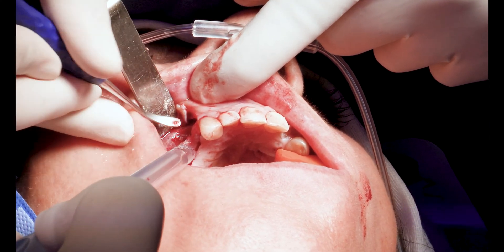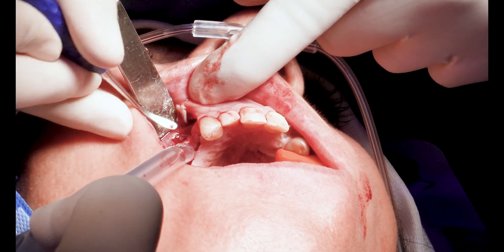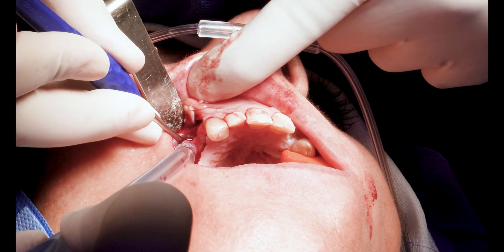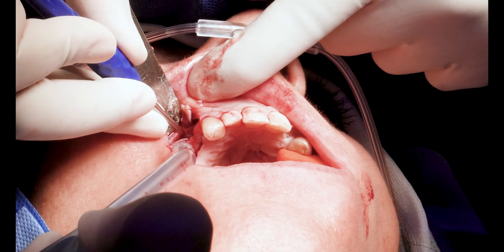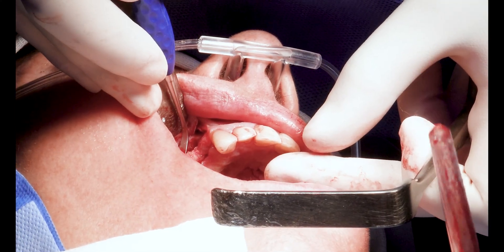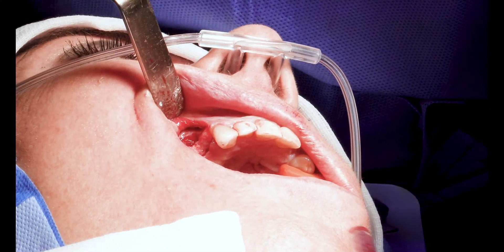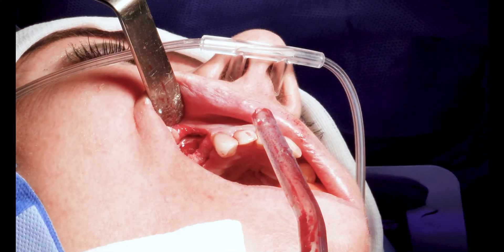We can also use a piezo if you feel more comfortable with this instrument, but in my experience a tungsten bur will work just fine once you get the hang of it and feel comfortable with the pressure you make on it — it shouldn't give you any trouble. Now we start freeing the Schneiderian membrane from the floor of the sinus, making sure I'm touching the floor with the tip of the freer and working myself around it, going a little bit deeper each time.